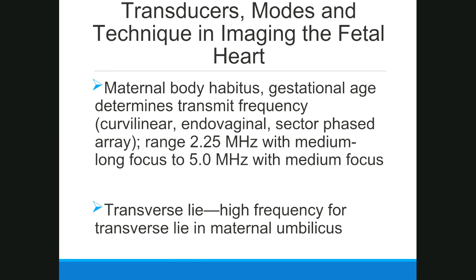I know that sounds crazy, but it can work, and you can get that really high frequency transducer to try to penetrate some of that and kind of close that air barrier from the belly button. And sometimes it works, sometimes it doesn't, but it's definitely something to try.